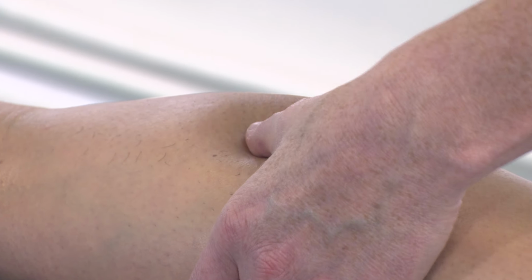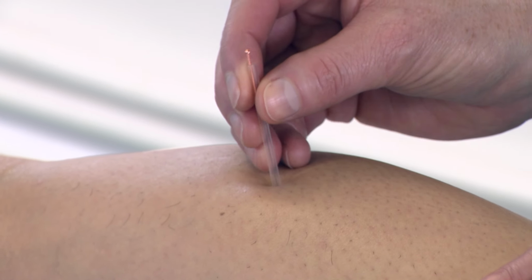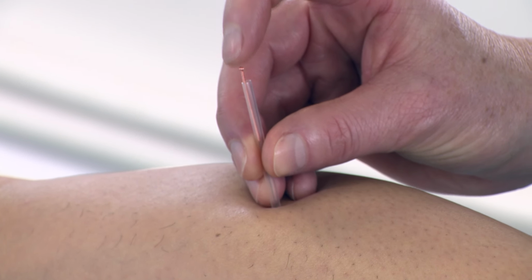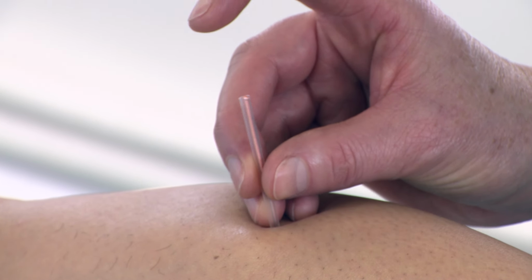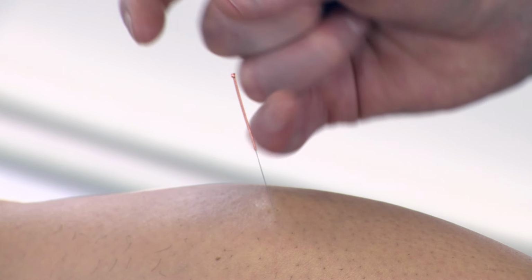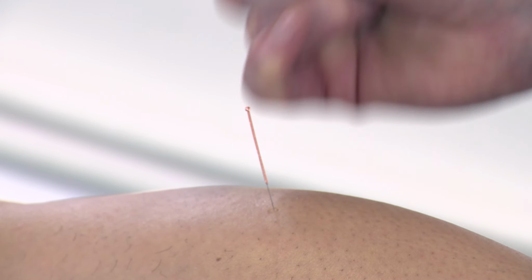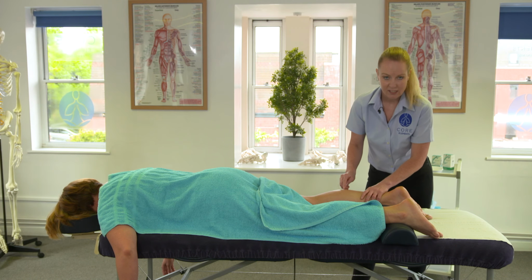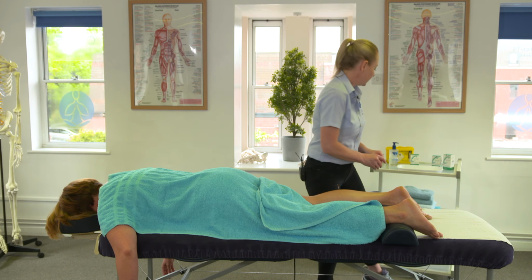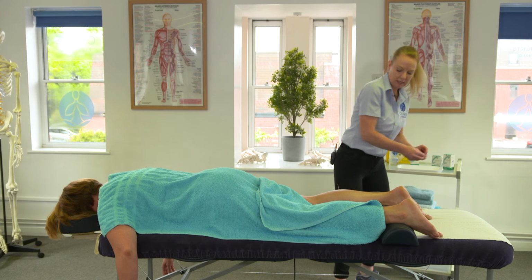I've taken the stopper off the needle, and then from here, I'm using that perpendicular action. I can see that the needle is sticking out of the top of the tube there, so I'm just going to gently press the needle in. We don't need to do any firm knocks with the needle with most of our clients, and then from here I'm going to press down roughly about halfway, and now the needle is inserted into that common trigger point. I'm going to do all of the needles first before we activate the needles.